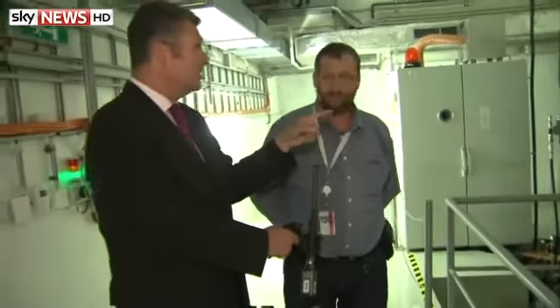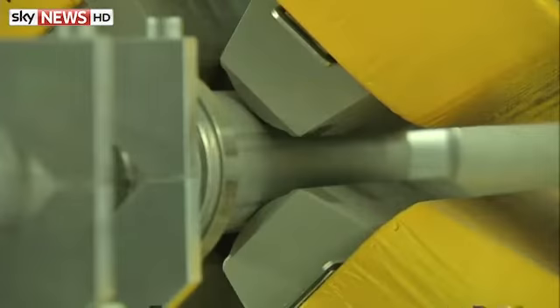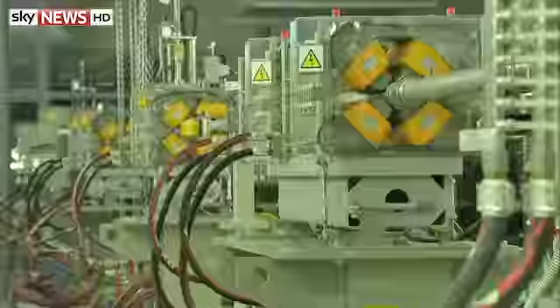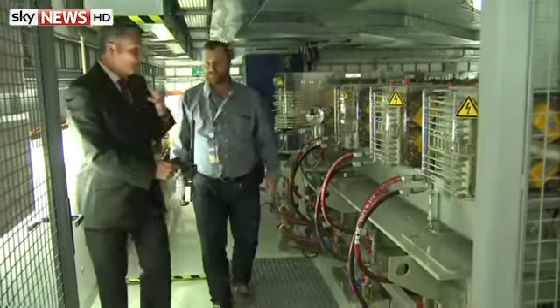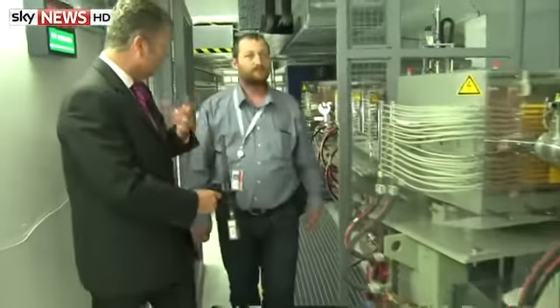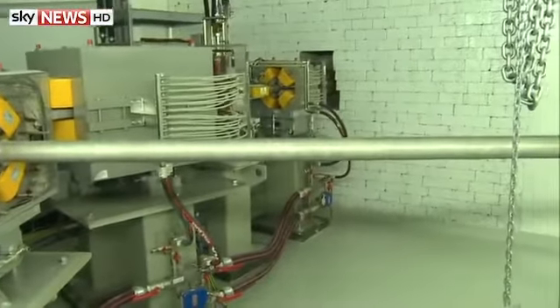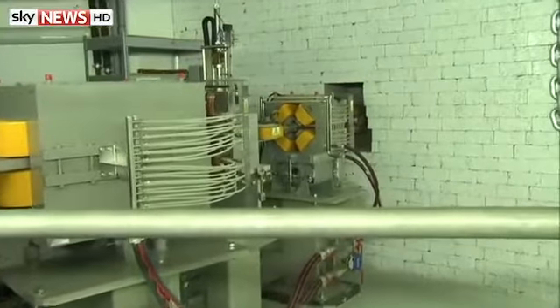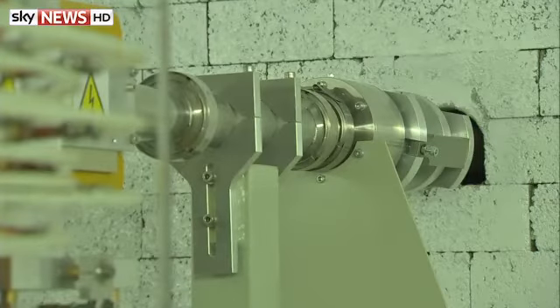So if we walk through, then we can see the protons come out of the big grey hub and are fired down here, I presume. Yes, sure. If you can see the metallic tube inside, this is the path of the protons. All the yellow stuff on it are the magnets that are basically focusing the beam or curving the beam trajectory to go to the correct place. So all of this ends up concentrating on one single tumour, one single cancer, in one single patient in a treatment room? Yes, exactly. In this line, there is a very thin proton beam which is going directly to the treatment room, and then the beam is directed precisely to the point where we want to have it.